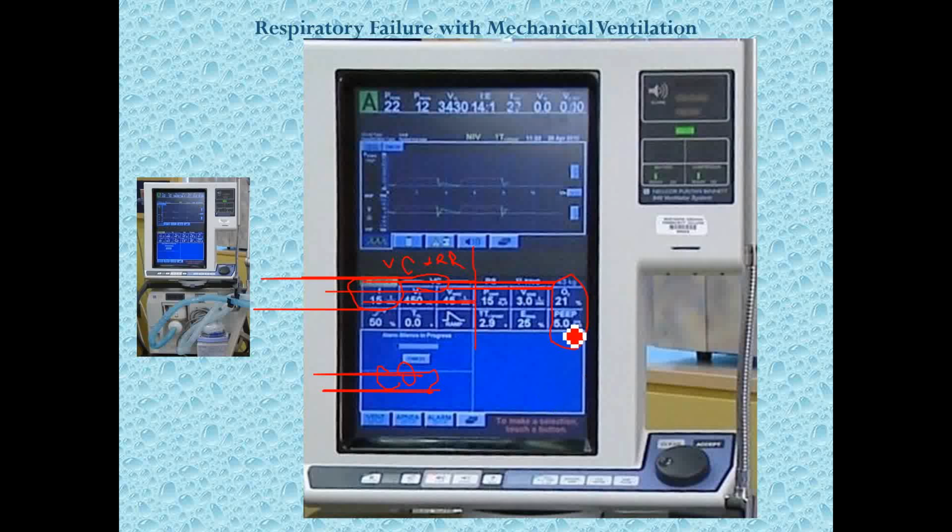Now on this ventilator you can see that supplemental oxygen is being delivered at 21%. It's also known as FiO2, the fraction of inspired O2. That's the same thing as saying extra O2. So if I were to ask you, what are you breathing right now? You would know that the legal drinking age is 21, and that's what room air consists of, 21% O2. On a ventilator, we can set it at room air if the patient doesn't need extra air. But let's say the patient is profoundly hypoxemic, well, then this number is going to have to go up.